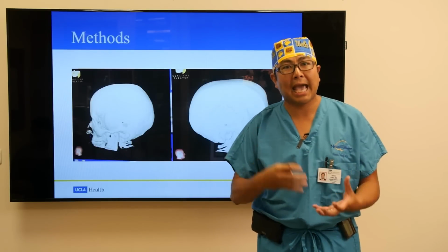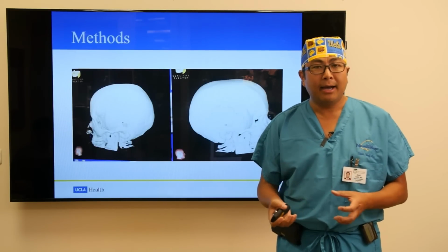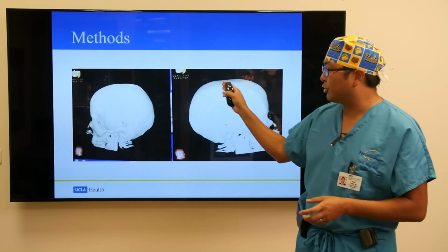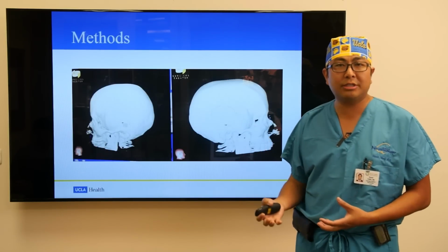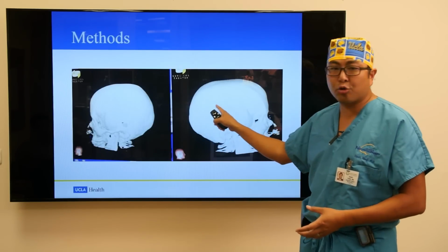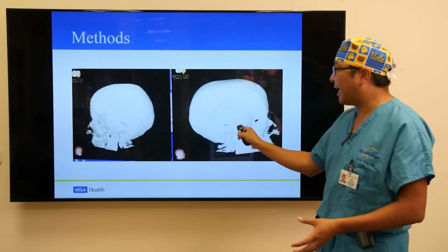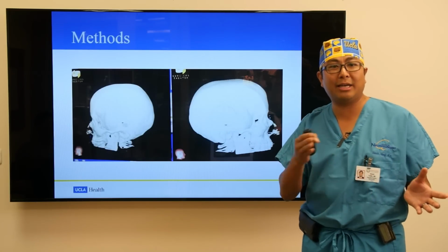Well, here's what's happened, and here's what's changed. This is what we've developed at UCLA, the mini keyhole craniotomy. And this, we're really fortunate to have. This is from Surgical Theater. This is the company that helps us do 3D reconstructions. We use this in the OR. This is one of our patients that had the old craniotomy. You can see they had the old mini middle fossa craniotomy done here. They had this done on their right side. And they came to us between 2011 and 2014.